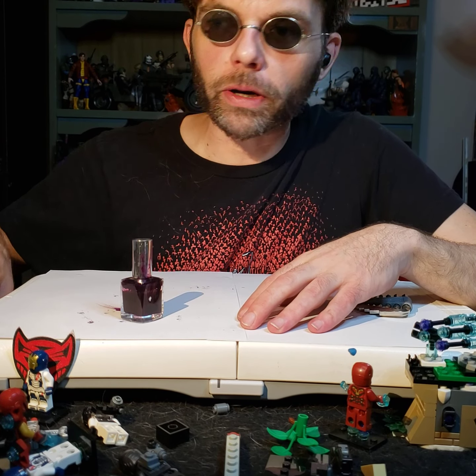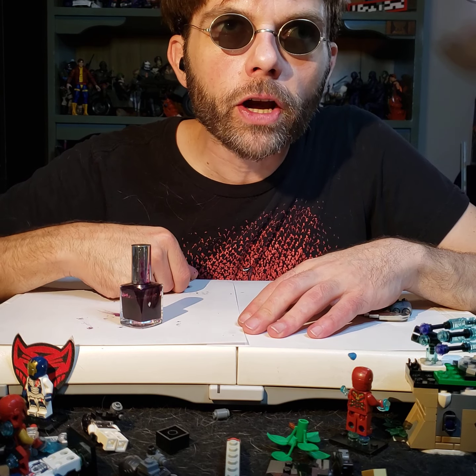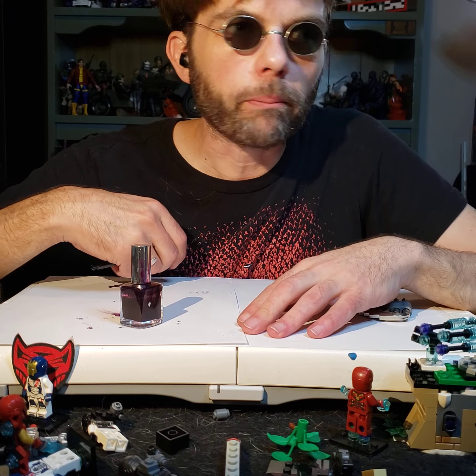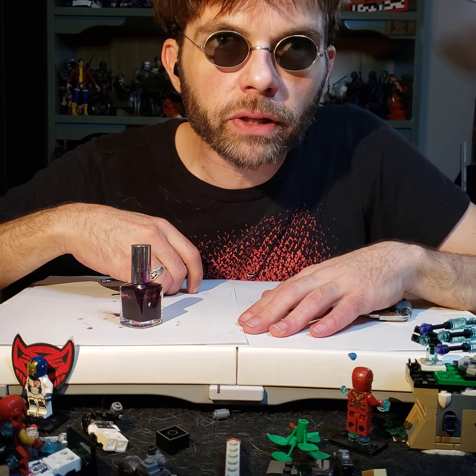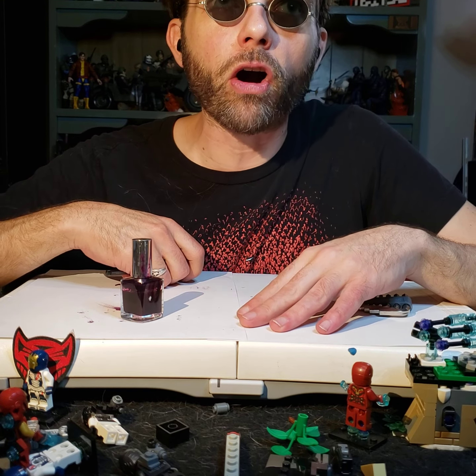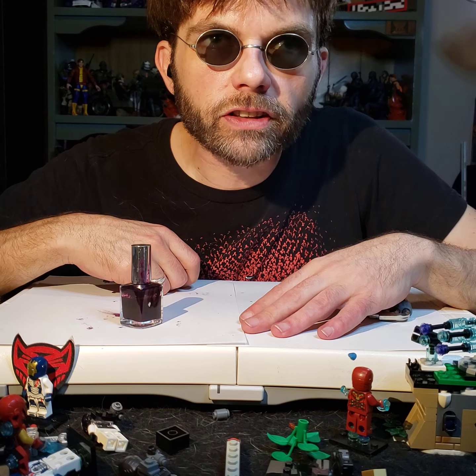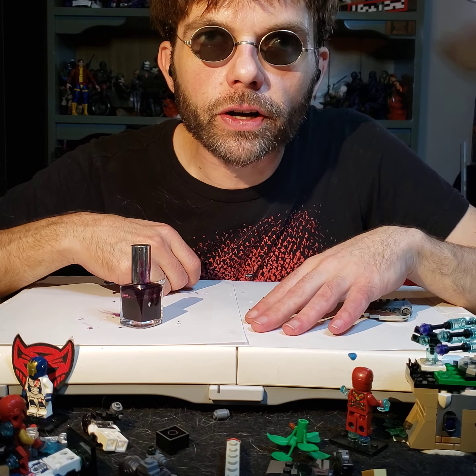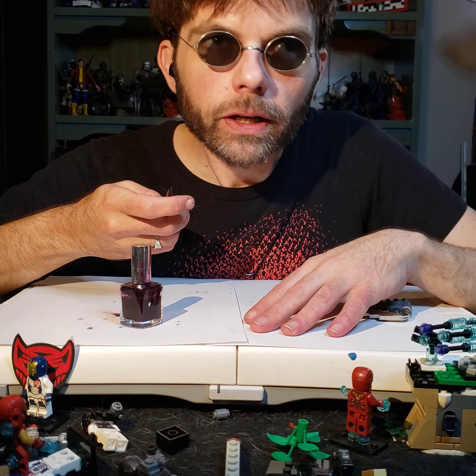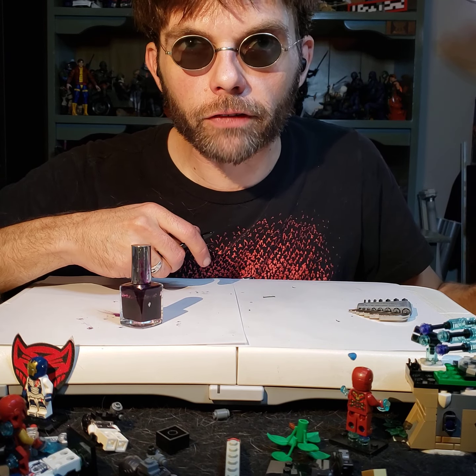Thank you all so much for watching today's video, and I hope today's video helped you out with maintaining and operating your collapsing carbon fiber canes. Mine are by Chris Park Designs, but there are plenty of different options out there for carbon fiber collapsing canes, but they all have the same repair job. You just need to unscrew the Allen wrench at the tip and put some nail polish on it, unless it's cracked. If it's cracked, you're screwed. You're going to have to get a new cane if any of these sections cracks. That is just an FYI.